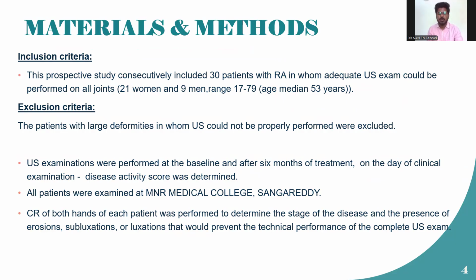Ultrasound examinations were performed at the baseline and after 6 months of treatment, on the day of clinical examination. We also took the disease activity scores and calculated them. All the patients were examined at MNR Medical College, Sangareddy, and on the day of examination at the baseline, we also took the conventional radiograph of both hands of each patient so that we can determine the stage of the disease and the presence of bone erosions, subluxations, and luxations that would prevent proper technical performance of the ultrasound, so that we can exclude them from the study.